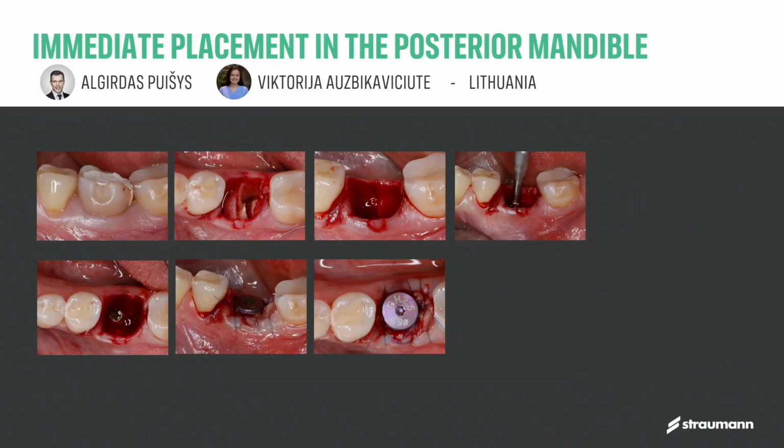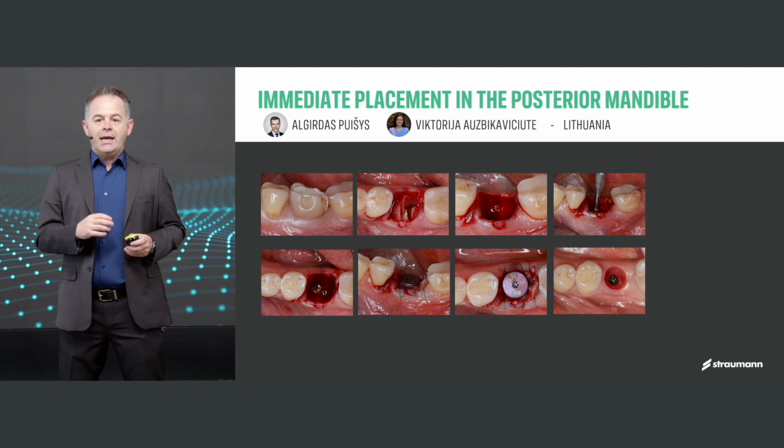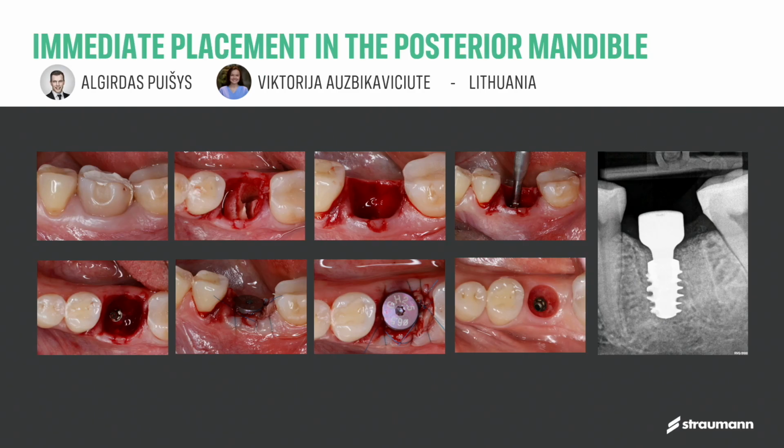And the next thing we see is how surgeries are normally concluded. You place a healing abutment, you make single sutures to bring the tissues closer to protect that wound. And as the healing goes by, when we remove the healing abutment, that's what we see. It's a very beautiful healing process. Here comes the interesting part, because as you notice, the healing abutment has this flaring following the emergence profile, but then it comes up very cylindrical.